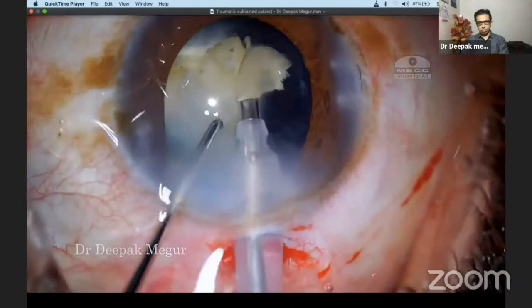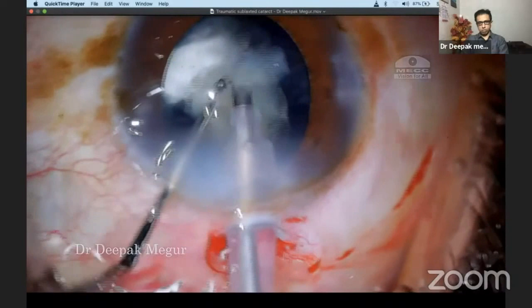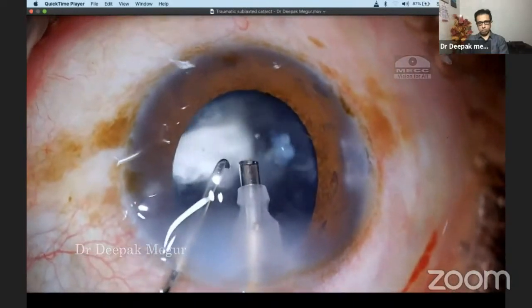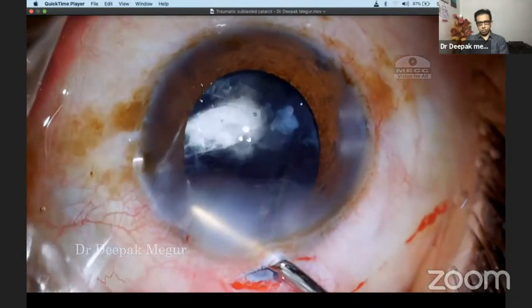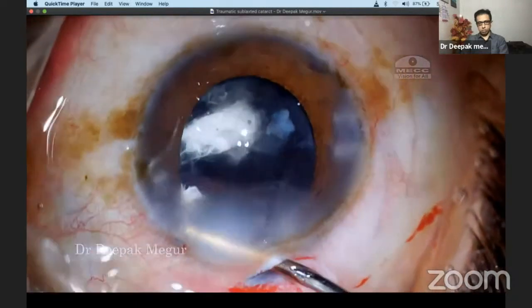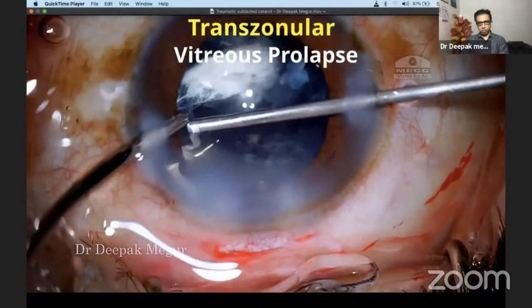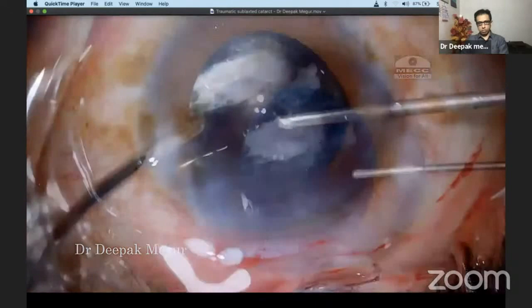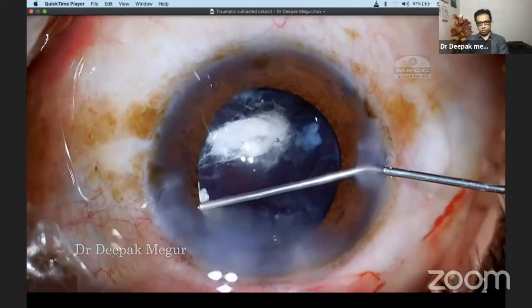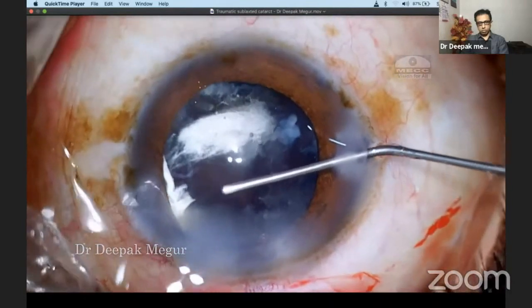The final two fragments are emulsified quite easily. The white plaque you're seeing behind the posterior capsule is actually the vitreous which is stained with the triamcinolone acetonide we had used. We can see there is still some amount of vitreous prolapsing through that area. At this point, I thought the best way to tackle this is by using a pars plana approach, because we can access the vitreous from behind and then do a decent anterior vitrectomy.